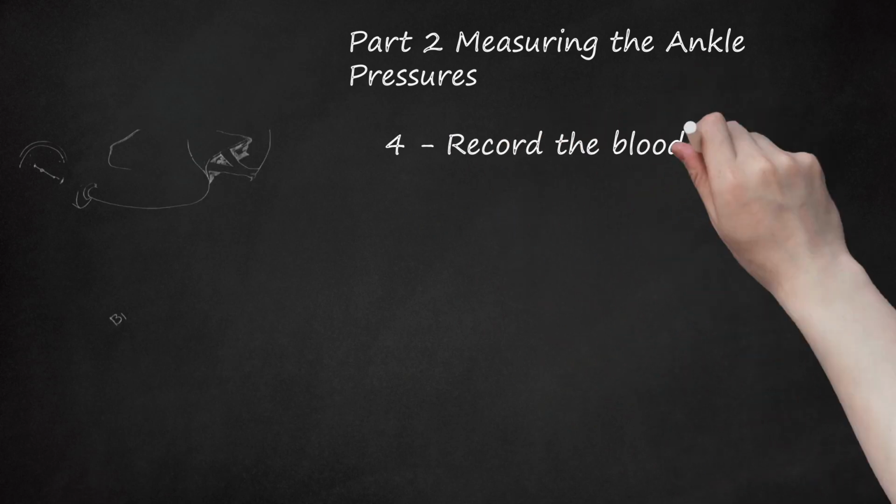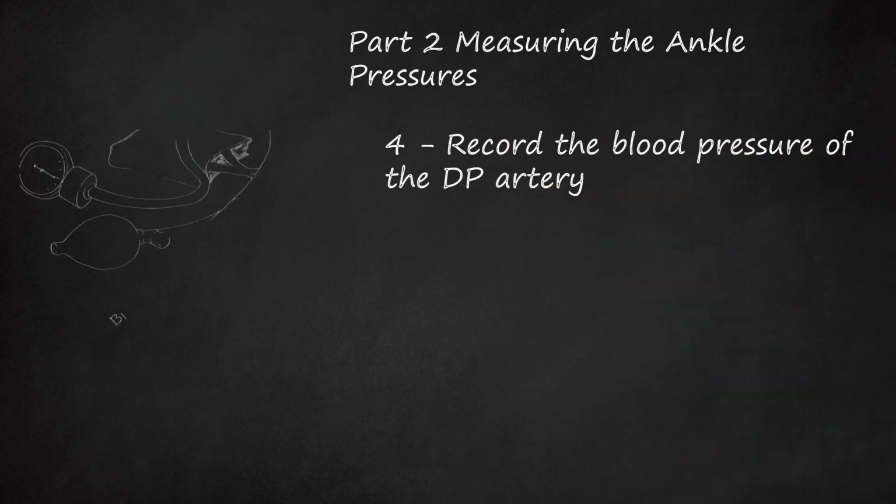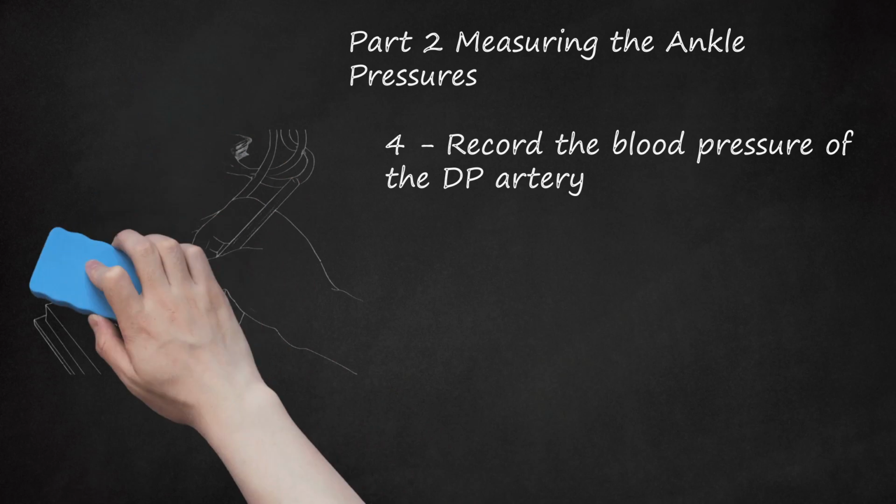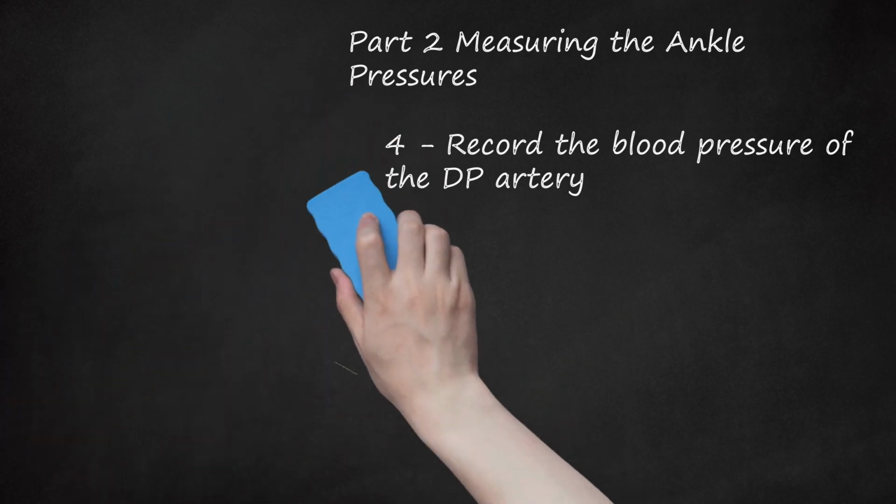4. Record the blood pressure of the DP artery. Inflate the blood pressure cuff to about 20 mm of mercury above the patient's regular systolic pressure or until the whooshing sound from the Doppler is gone. Deflate the cuff and take note when the whooshing sound returns. This is the systolic blood pressure of the ankle.